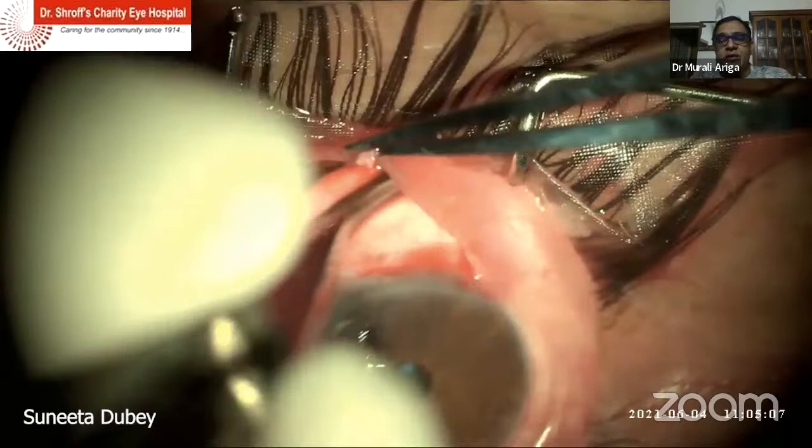And make sure you have a clear plan when you're planning to place the mitomycin. There are so many methods of placing the mitomycin. Some people place the mitomycin before the flap is made. I have now switched to placing the mitomycin after the flap is made, the triangle flap. People say that the chances of hypotony are more when it is placed after the flap is made, but it has not been so in my experience.